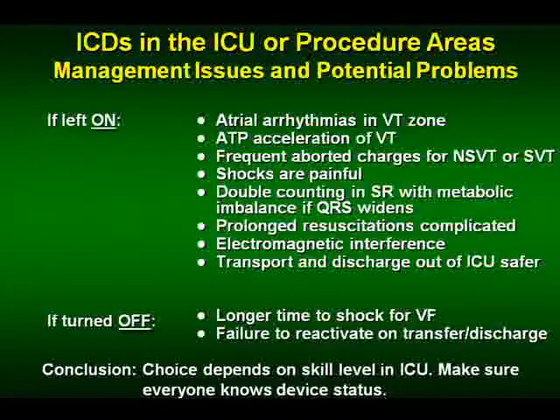So, in fact, I think the biggest choice is, if somebody has an ICD and they're in my intensive care unit, do I leave it on, or do I turn it off? Well, if you leave it on, you have to worry about atrial arrhythmias, so you may want to change your VT zone. You may worry that even sinus tachycardia may get up to the rate of VT in somebody who's very ill. You don't want to treat that.